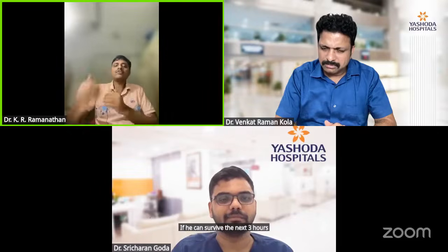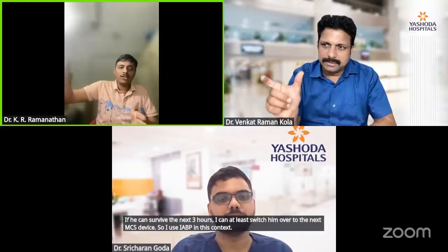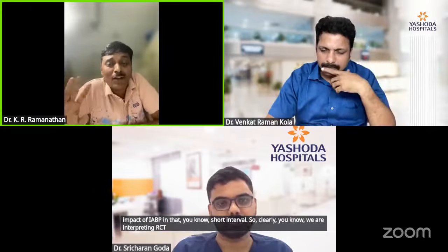If he can survive the next 3 hours, I can at least switch him over to the next MCS device. So I use IABP in this context as a bridge to the next MCS device. Clearly, these RCTs have not looked at the impact of IABP in that short interval. So clearly, we are interpreting RCTs wrongly, if you ask me, and we are just extrapolating what was found at 28 days to what is happening within 2 to 3 hours.